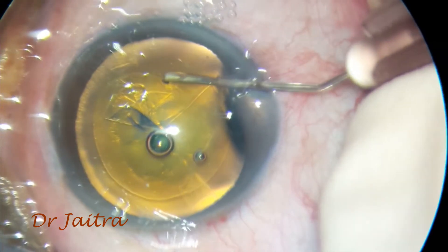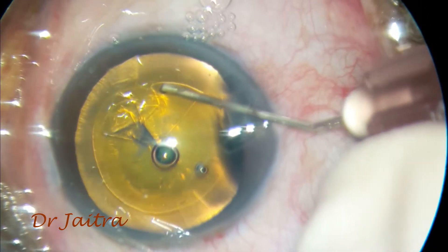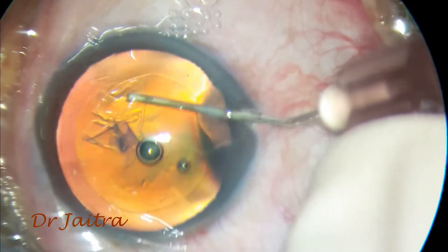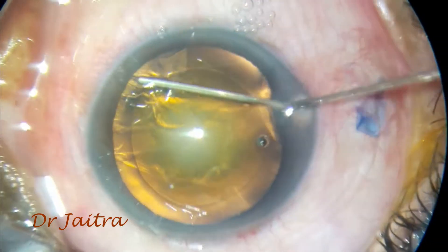Otherwise the rhexis flap can come into the incision and the rhexis sub-incisionally can go out. So you have to be very careful. In this case, the elasticity of the anterior capsule is very high.